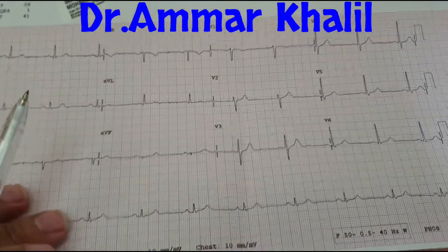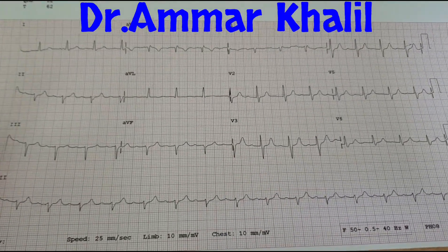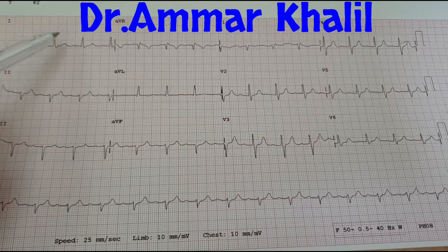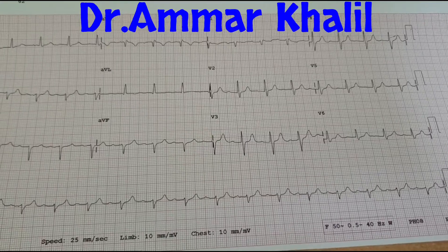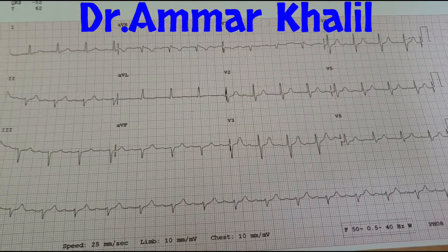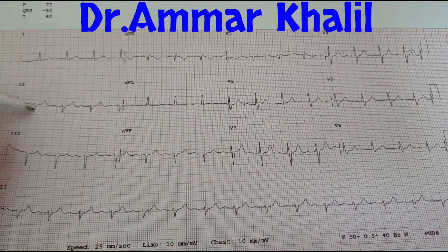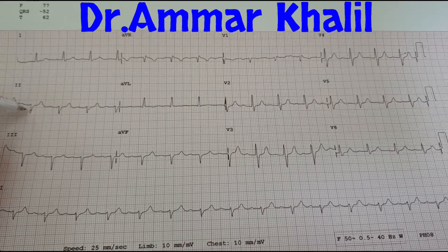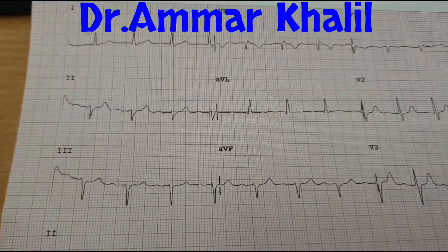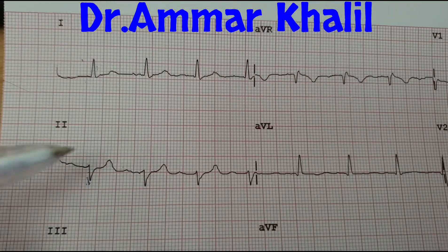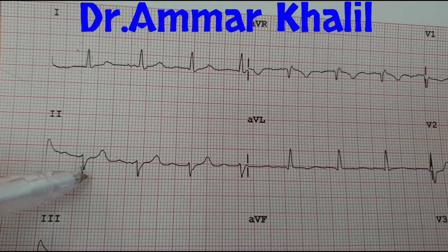For the second patient, looking at lead one and lead two — see the R wave in lead one and the R wave in lead two. Here it is positive and here it is negative. So this is called left axis deviation. As you can see, this is lead one and lead two clearly. The R wave here is positive, and in lead two it is negative — a downward deflection.